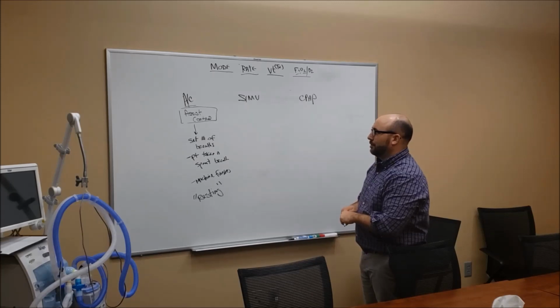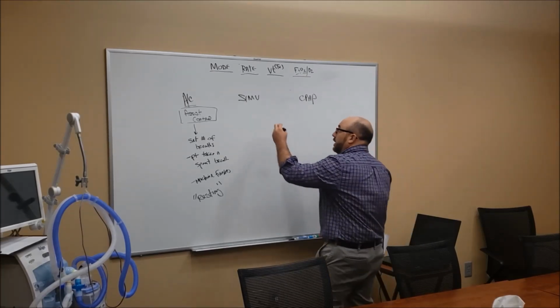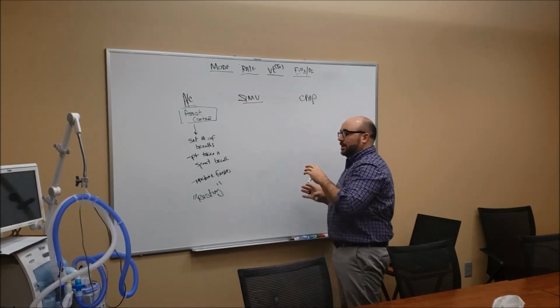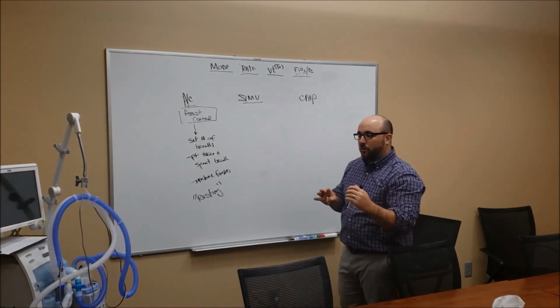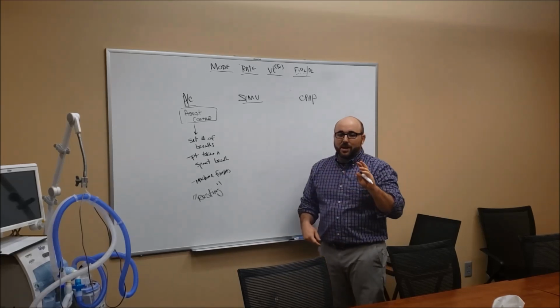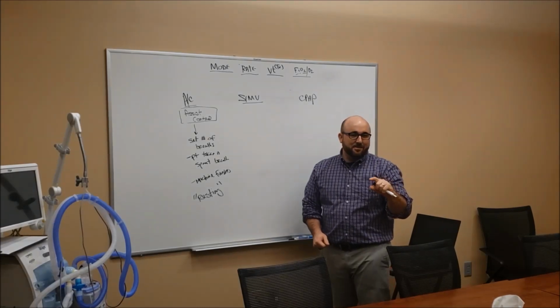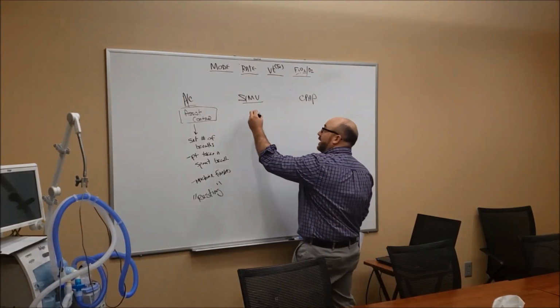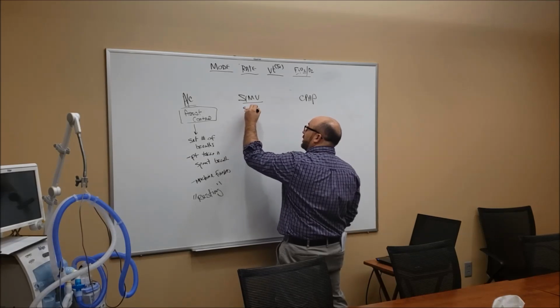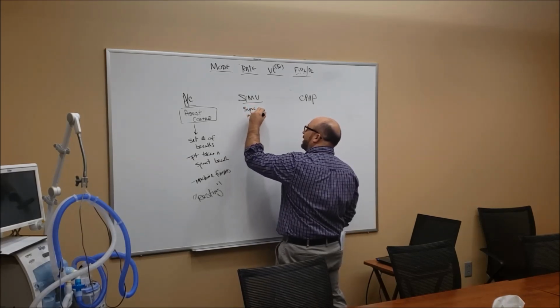And just so you know, because this is the initial mode we put almost all of our patients on, don't get too hung up on this one. This is SIMV. This is more of a weaning mode. You may see it down here. This would be a major bonus point if anybody knows what this means. Probably may not even go over to school. Synchronized, intermittent, don't even write this down really.